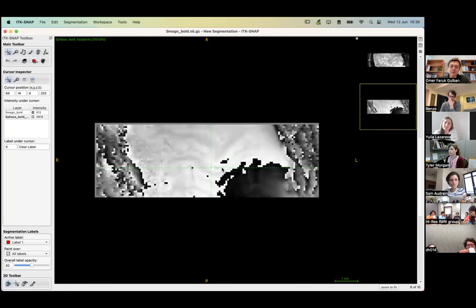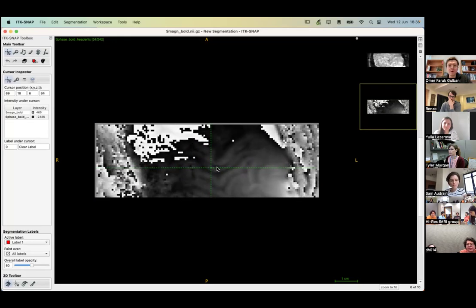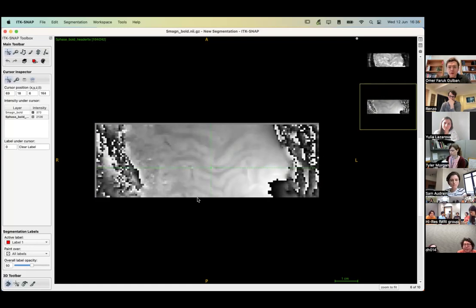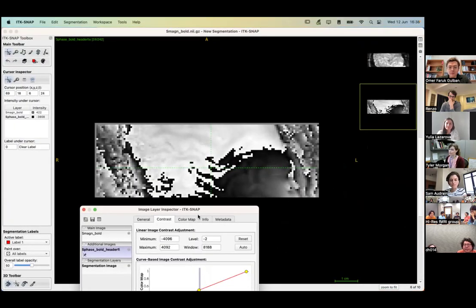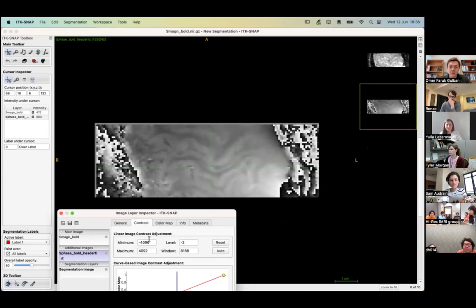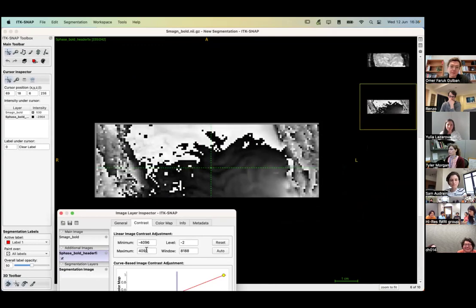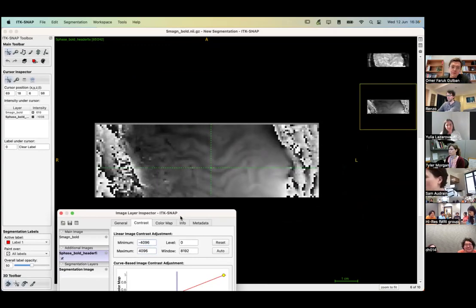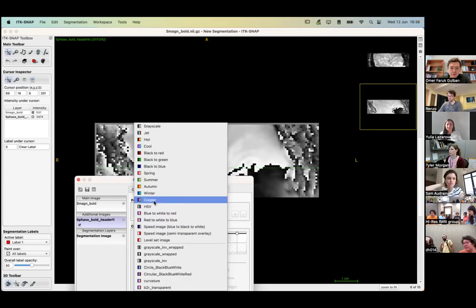And this is the phase component of it. And you can hopefully see that it looks somehow more complicated and maybe confusing, maybe worse in certain ways. But basically the essential thing here is that the phase component is a circular measurement, which means that it is scaled between 0 to 2 pi or minus pi to pi, or as it comes from the Siemens scanners, most of the time minus 4096 to plus 4096. And that happens to be integer 13 range somehow. Someone coded it in that way. And it's a circular measurement.